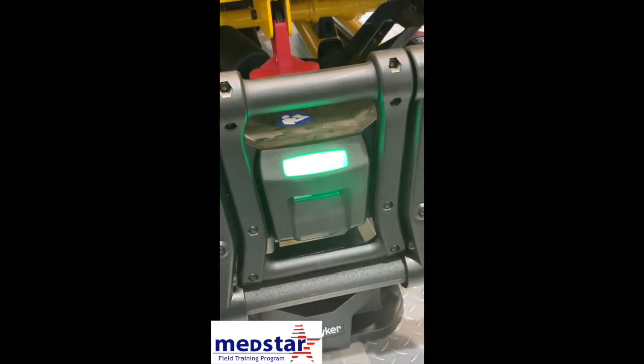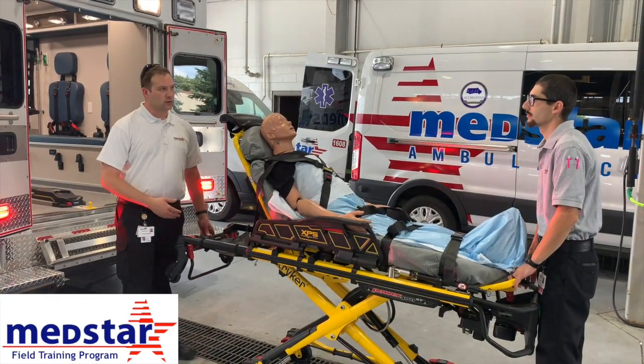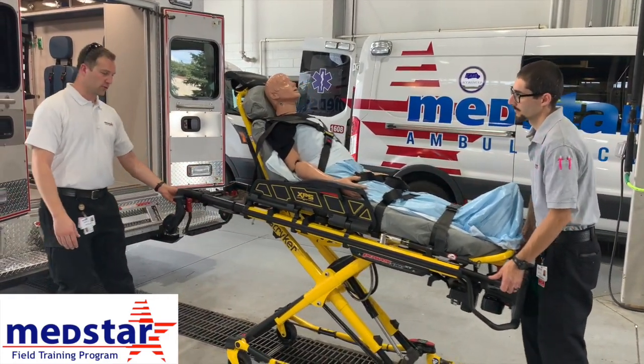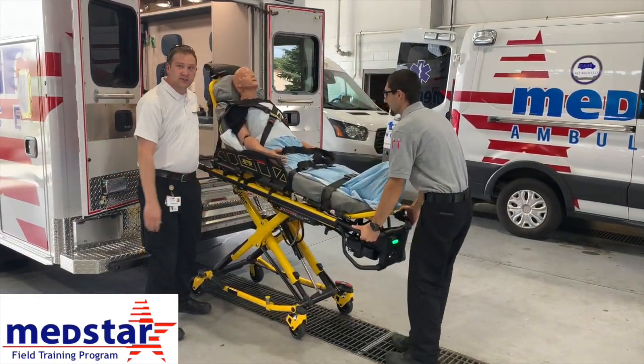Now we're going to pull the stretcher out and show you some of the other functions. We're going to discuss loading the stretcher into the vehicle. Push and hold the plus button until the stretcher stops — it should be at loading height to latch in the vehicle. Then roll it up into the vehicle and make sure it actually latches.